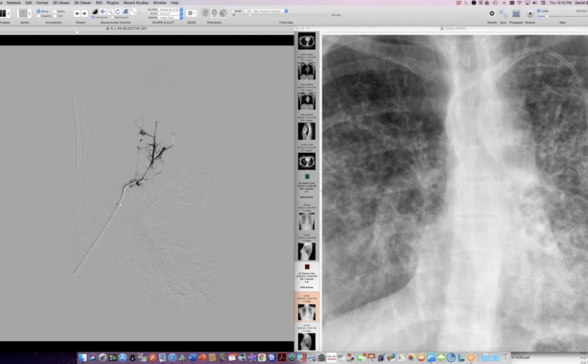this down. So here's a case of cystic fibrosis with some improvement in her diffuse mucus plugging, probably because of Trikafta. I need to check that to make sure I'm not misleading you. But you know, with her chronic problems, she's still susceptible to some of the bad things that happened to her before she was put on that effective therapy. So she's left with cavities and the potential for bleeding from erosion of pulmonary arteries and so forth.